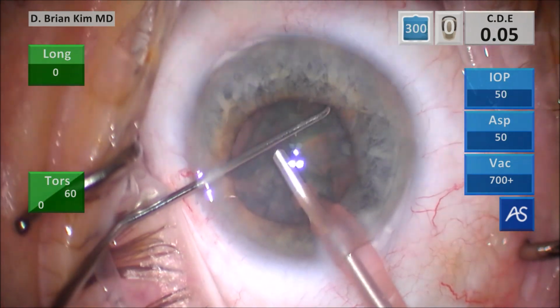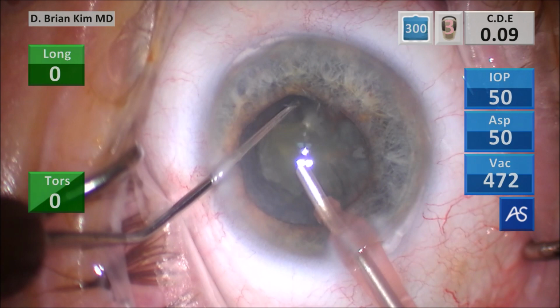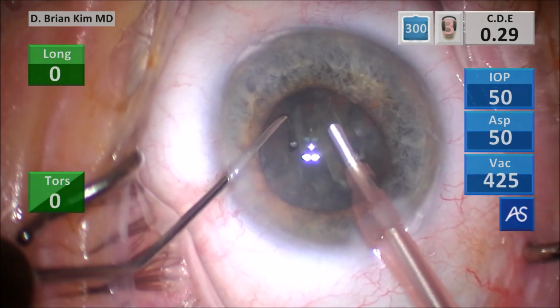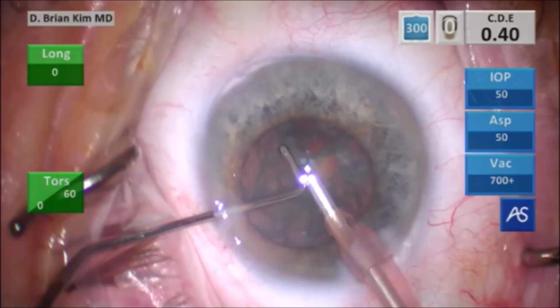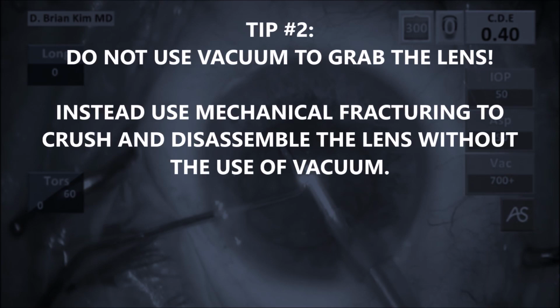I'm placing the chopper around that first quadrant, lifting it out of the bag very carefully, and then I'm starting to emulsify the lens. It's very important that I pull out the lens. This is tip number 2. Do not go after the lens pieces with vacuum in this situation. If you do, you might grab the pupil.